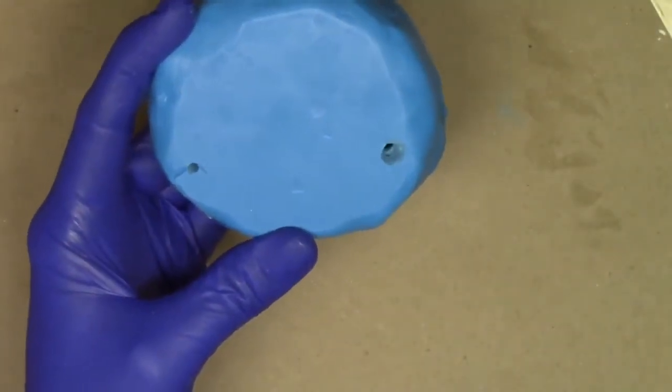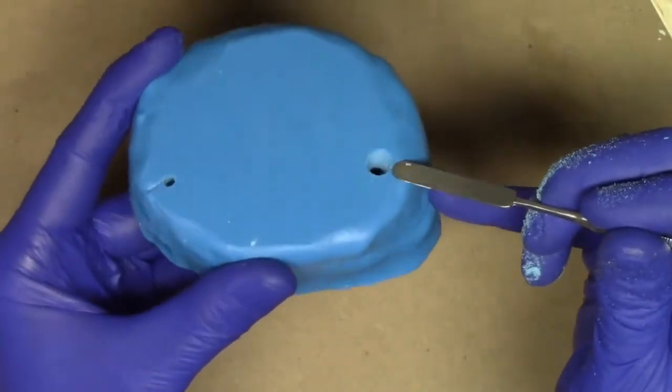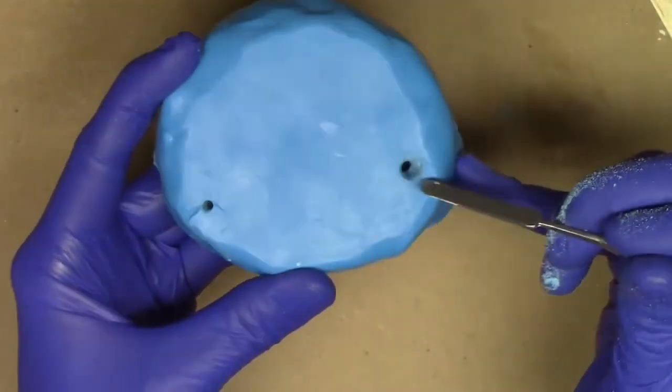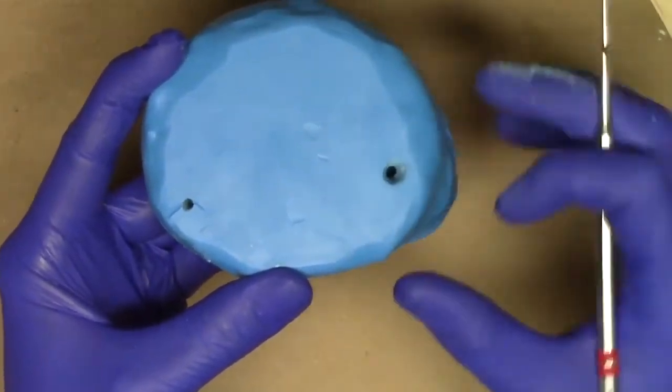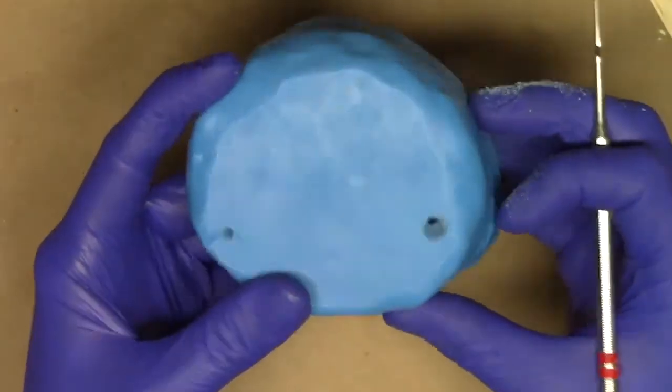Also, I've created a little bit of a reservoir channel right in here. This is just a little bit wider in here. I like to fill that up so that way it resists some of that pulling motion that acrylic resin does.